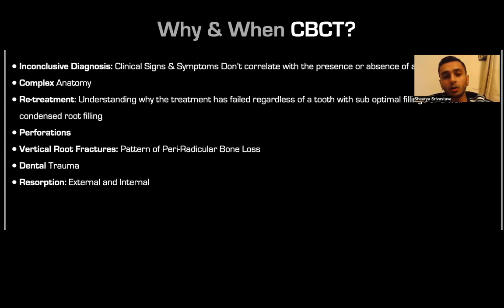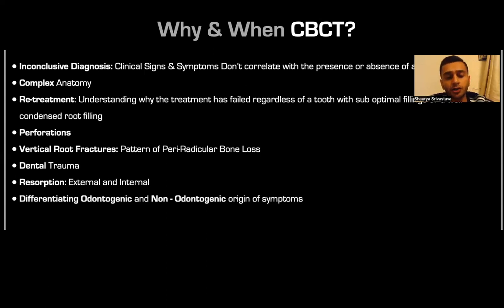Resorption, external, internal. We'll talk about the new classification, 3D versus the 2D from Heithersay from the early 1980s. Differentiating odontogenic and non-odontogenic origin of symptoms. Again, when you have an inconclusive diagnosis, something says that it may be this, but you're not too sure. Say if it's a vital tooth, you have a lesion there. How do you confirm that?